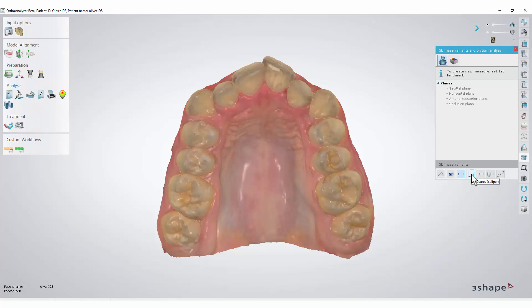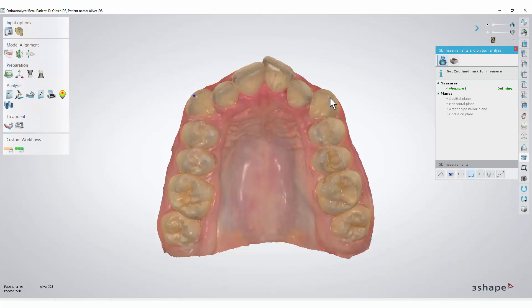For example, we will take the caliper measurement. Click the left mouse button to place one point on each cuspid, and the cuspid-to-cuspid distance will be measured.